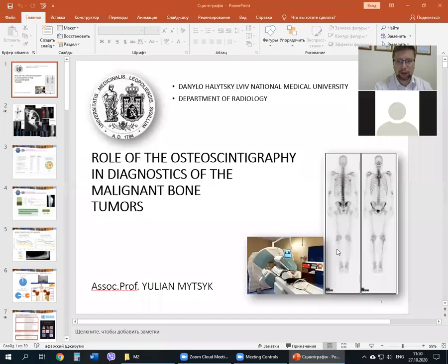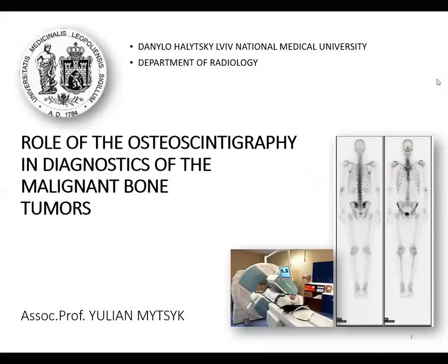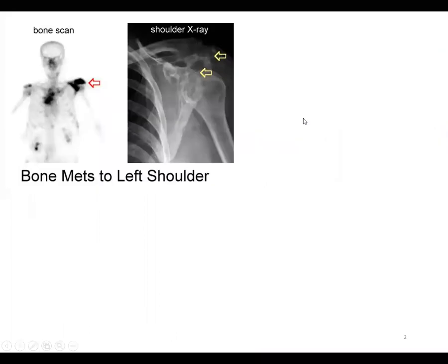Good morning, sir. This lecture is dedicated to the role of osteoscintigraphy in diagnostics of the malignant bone tumors. As an introduction, I want to show you this slide, on which you can see how the detection and imaging methods of the tumors of the bones evolved and developed in time.